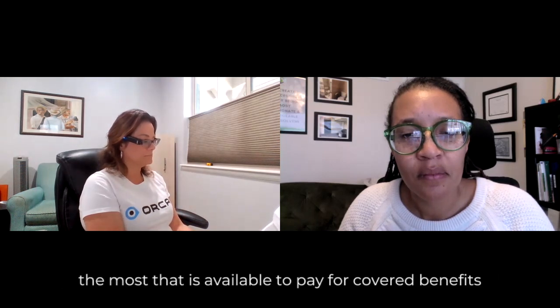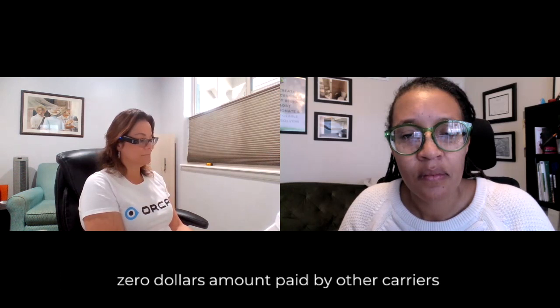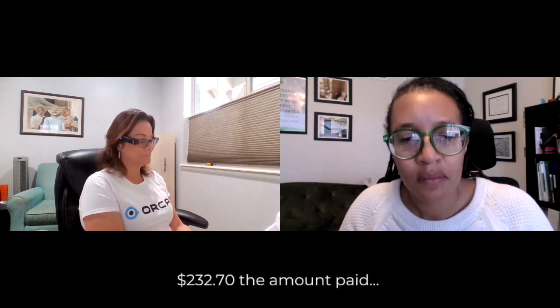Okay. And how do you do that without really being able to see and point out what you want? So I'm going to ask it to go into a smart reading mode. Hey, OrCam, start smart reading. Note that some of the text was unreadable. Ready. Read amounts. First result, dollar amount description. Second result, $267.70, the most that is available to pay for covered benefits under your plan. Third result, $0 amount paid by other carrier if applicable. Fourth result, $232.70, the amount paid by. So as you can see, it read all the information that I needed, and I'm going to be able to extract the amount that I owe.